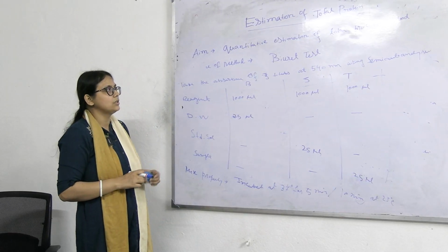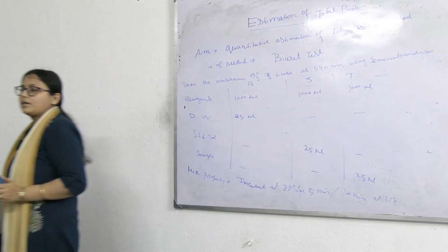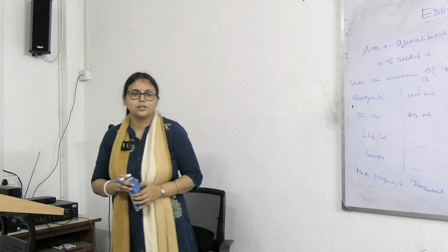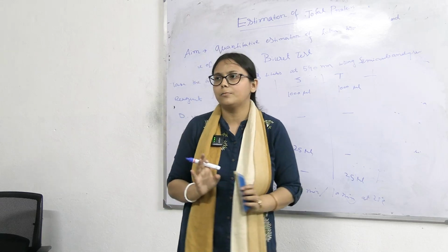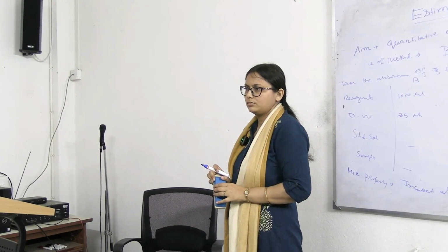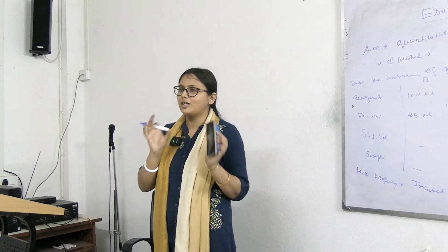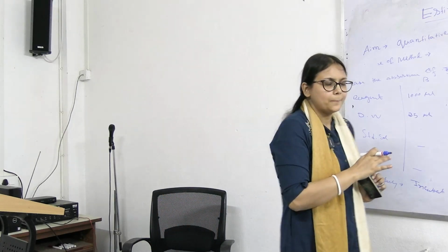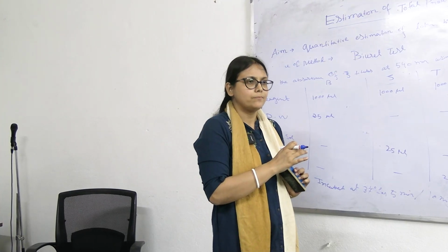The semi-auto analyzer works via the colorimetry principle. What are Beer's and Lambert's laws?